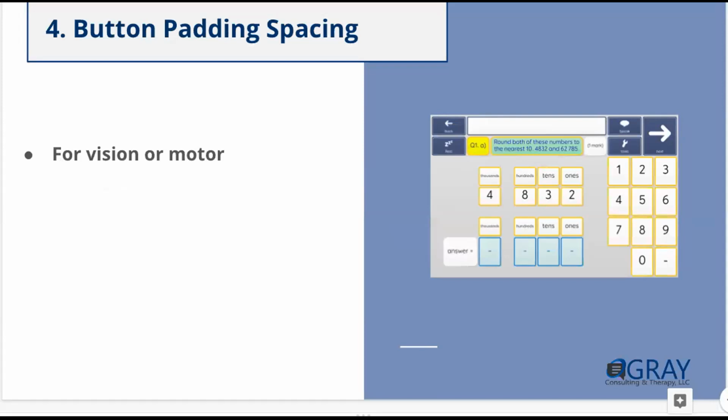All right, so one of my other favorite features out there for access. It'll be called different things across different devices: key padding, button spacing. But what it is, it increases the space around each button. So even though your locations themselves will become smaller, they are easier to access because there is a greater room for error.